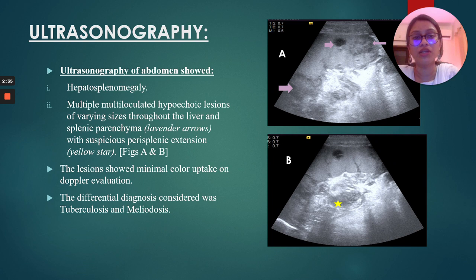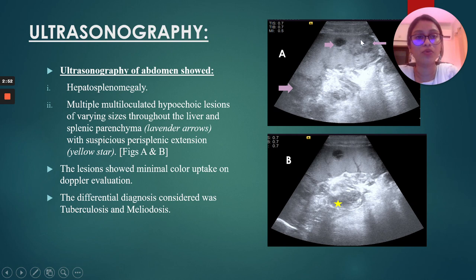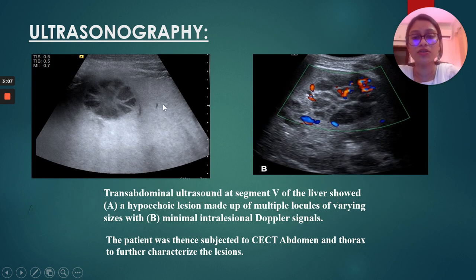Ultrasound of the abdomen revealed hepatosplenomegaly. Multiple multi-loculated hypoechoic lesions of varying sizes were scattered throughout the liver and splenic parenchyma. This image shows the spleen with definite splenomegaly and hypoechoic lesions scattered in both the upper and lower poles, with perisplenic extension into the gastrosplenic ligament. These lesions showed minimal color uptake on Doppler evaluation. Transabdominal ultrasound at segment 5 of the liver showed a hypoechoic lesion made up of multiple locules of varying sizes with minimal intralesional Doppler signals.